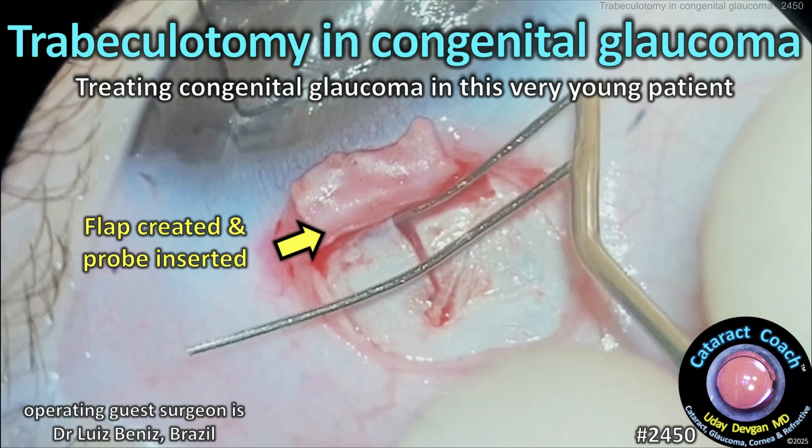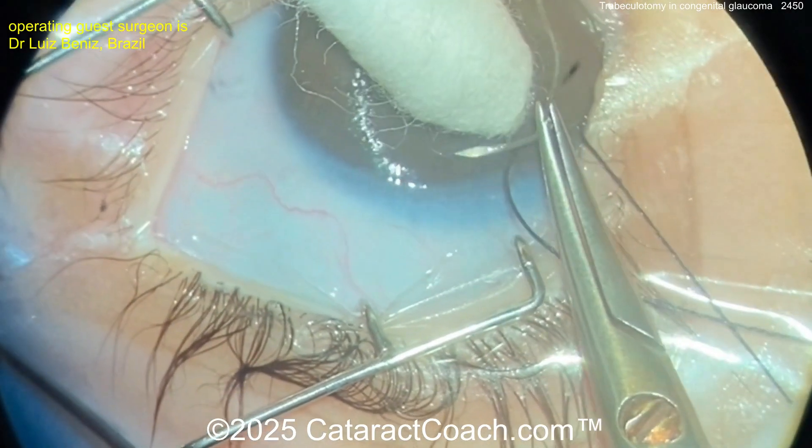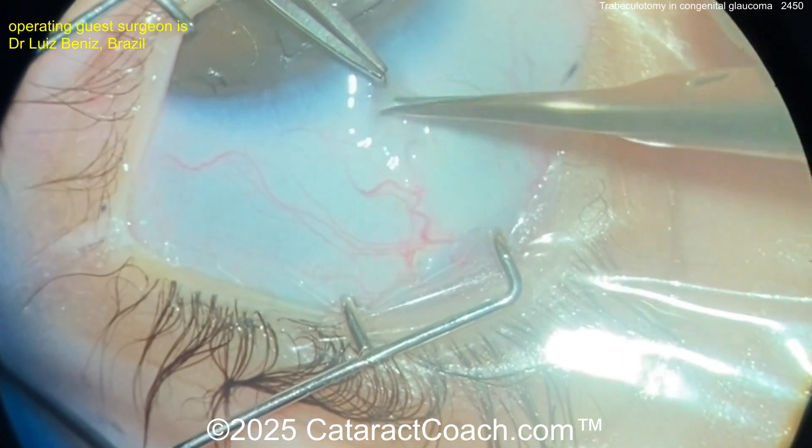cataractcoach.com — trabeculotomy in congenital glaucoma. Treating congenital glaucoma in this very young patient. On Cataract Coach we have all anterior segment surgery including cataract, cornea, glaucoma, refractive, and more.